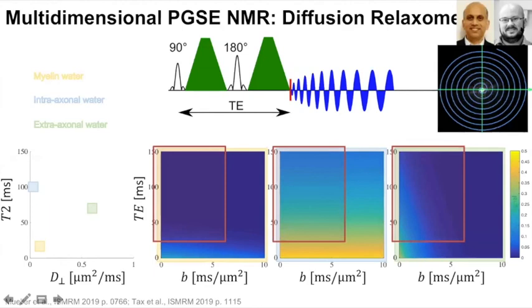So my colleagues Umesh Rudrapatna and Lars Muller have been working on implementing a spiral readout on the connectome, where you can start reading out immediately after the gradients, and then you can extend this measurement space even further. We use the field camera to correct these trajectories.